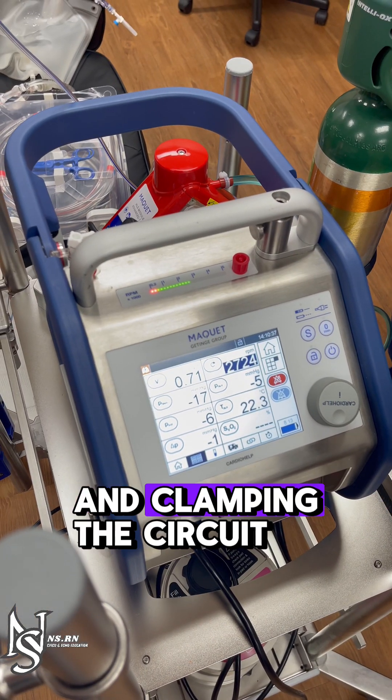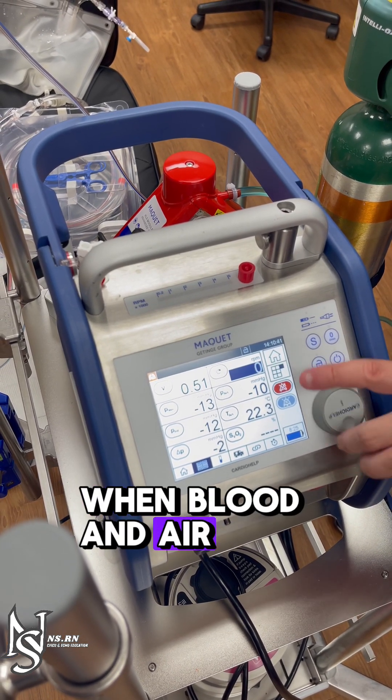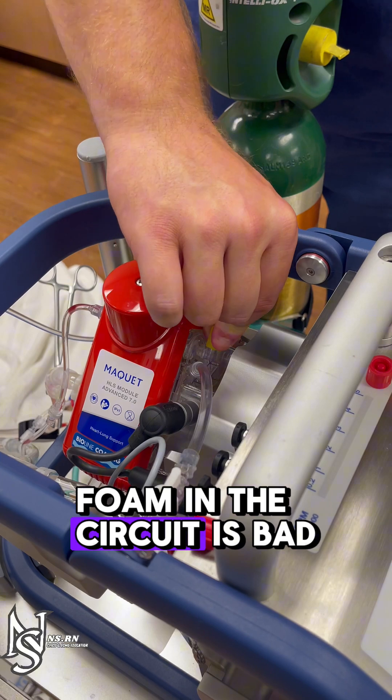Go down to zero RPMs. Clamping the circuit will always be your first two steps. When blood and air mix, it will turn into foam. Foam in the circuit is bad.